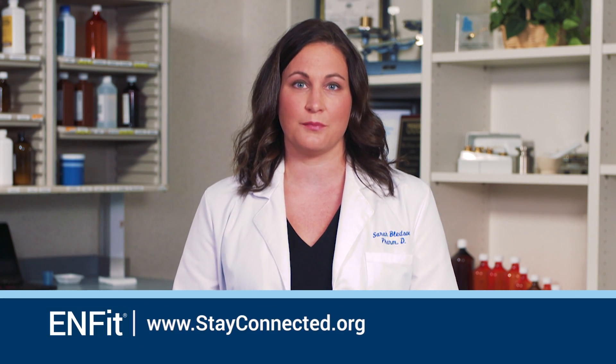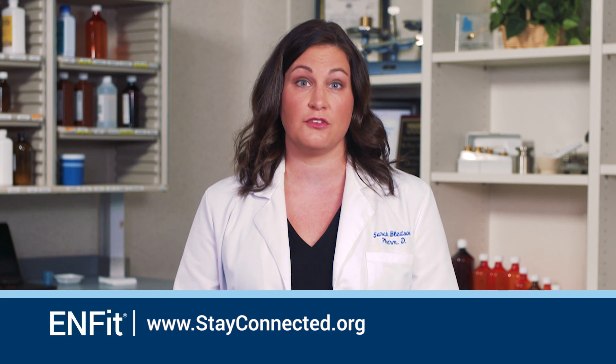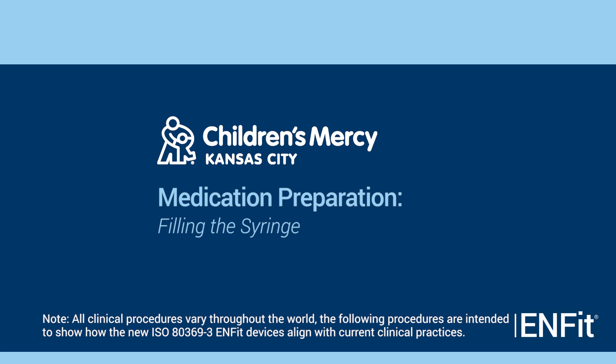For syringe performance information on the low dose tip and other currently available products, see GEDSA's ENFit low dose tip presentation. We will begin the medication preparation process by filling the syringe. This procedure will demonstrate filling an ENFit tip syringe from a medication bottle.